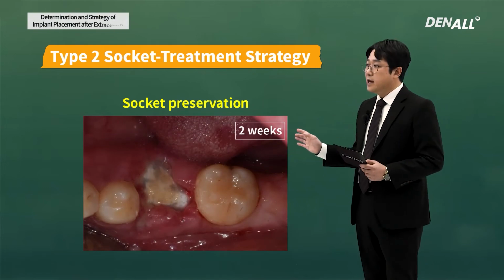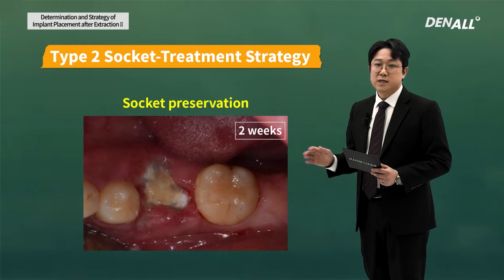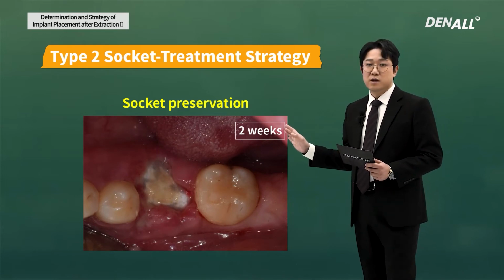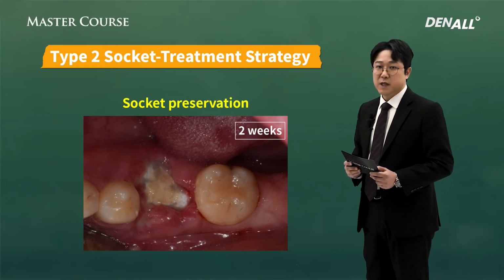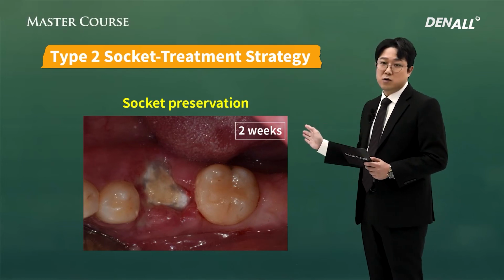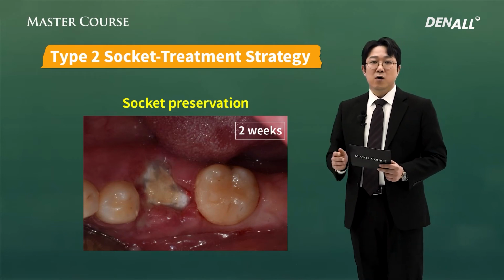This is after 2 weeks and suture was removed. You can see non-resorbable membrane has been exposed. If you can sterilize it every day, it'll be ideal, but if that's not possible, it's okay to do it every 2 to 3 days.